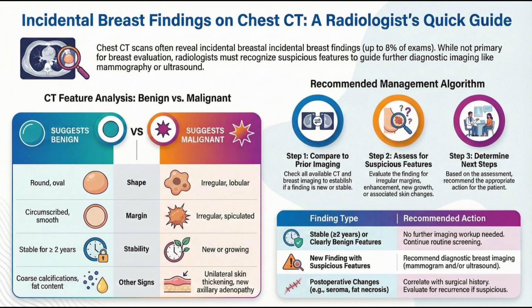That's why we're doing this deep dive. We're getting into the expert radiology literature that guides interpreters on this exact scenario. Our mission today is to unpack all of this. We'll cover the anatomy you can see on CT, how to tell the difference between benign lookalikes and truly suspicious lesions. And then get into the really complex stuff, like the post-treatment breast, which is a whole different rule book. It really does. Okay, so let's start at the beginning, the fundamentals.